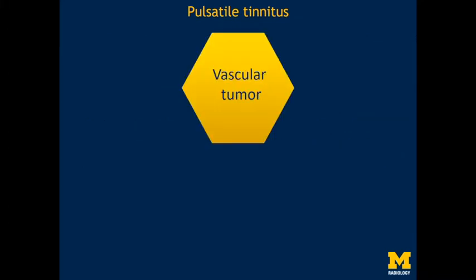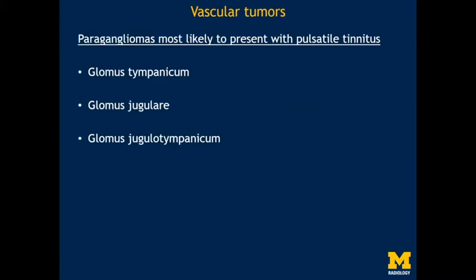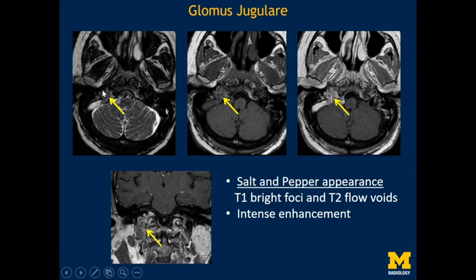When approaching pulsatile tinnitus, the first thing to look for is whether a vascular tumor is present — specifically vascular tumors in the vicinity of the temporal bone and skull base. One common entity is a paraganglioma, such as glomus jugulare, glomus tympanicum, or glomus jugulotympanicum. Here is an example of a patient with right-sided pulsatile tinnitus showing the classical salt-and-pepper appearance. Salt is the bright area on T1-weighted images; pepper is the presence of flow voids on T2-weighted images with intense post-contrast enhancement. This is a classical glomus jugulare on the right side.